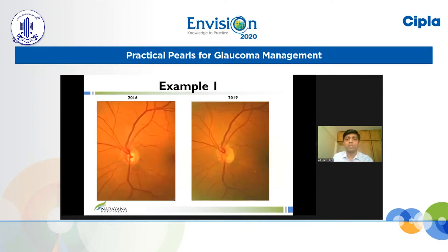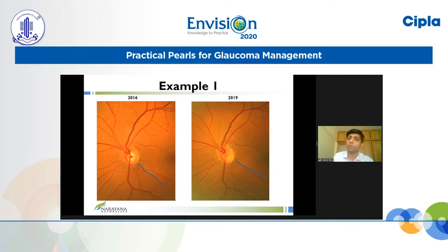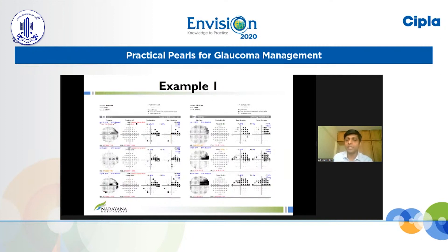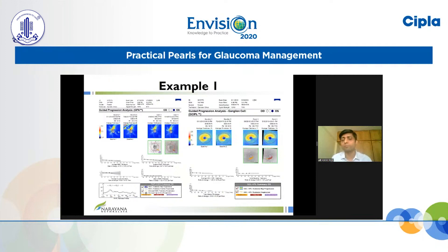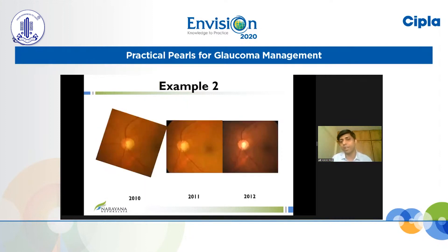Here is a patient followed up yearly with disc photographs. In 2016 versus 2019, the inferior RNFL defect is enlarging — the upper border of the RNFL defect has moved closer to the macula in 2019. The visual fields show a correlating enlargement of the nasal defect and of the parafoveal scotoma on 10-2 fields, and the GCC also shows correlating RNFL thinning and GCPL thinning. This is an example where all methods correlate well, making it easy to confirm progression.